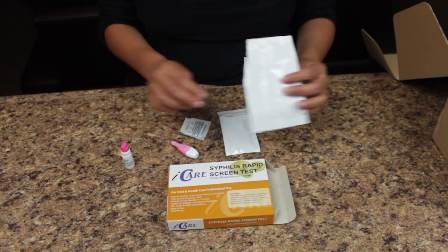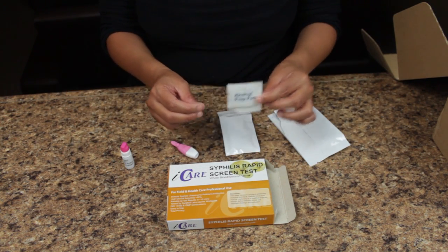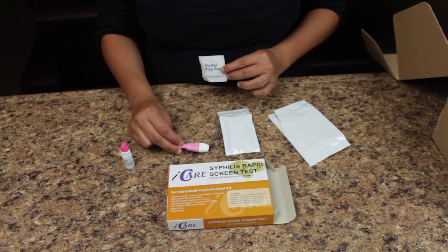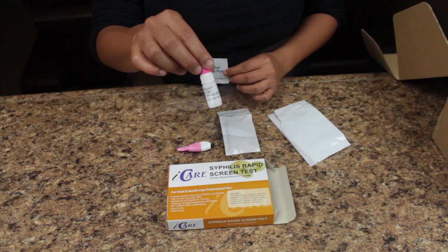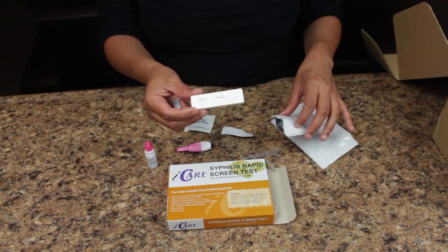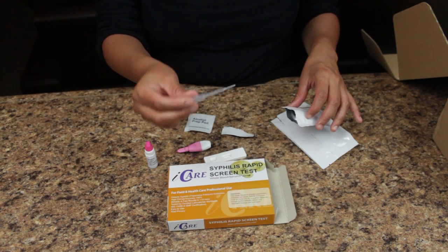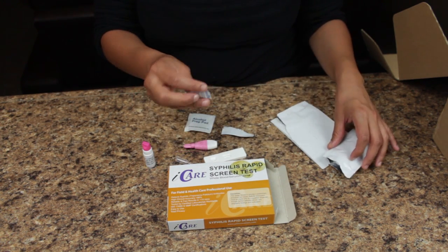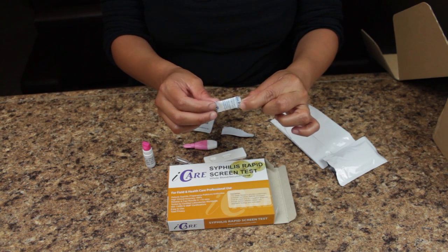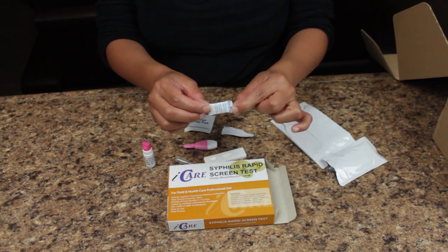Opening the main package, you will find an alcohol prep pad, a lancet, and a diluent bottle. In the test packet, you will find a plastic test cassette and a pipette or dropper. You will also find a moisture absorbent packet. The moisture absorbent packet is not to be used for the test and should be discarded immediately.